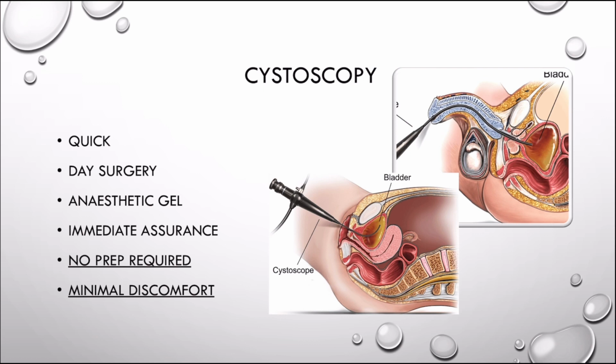This is usually a very quick 3 to 5 minute procedure. It's a day surgery. You will be given an anesthetic gel to numb the urinary tract, and it's immediately reassuring because we will be looking at the screen together with you, and we can investigate the bladder at the same time together to give you an immediate reassurance should there be nothing found. No prep is required, unlike some of the other procedures that you may have experienced, like an endoscopy or a colonoscopy, whereby you need to drink preparations the day before.